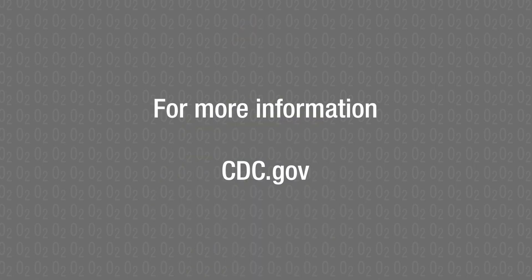This simple equipment is safe to use in children, adults, and pregnant women, and can help providers deliver life-saving oxygen to people who need it. For more information, go to CDC.gov.